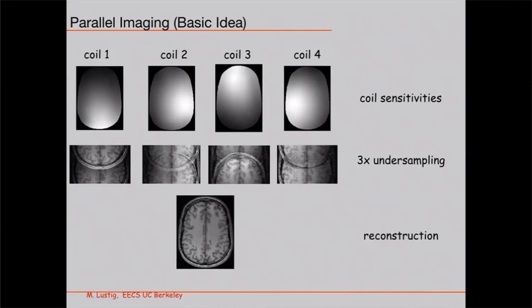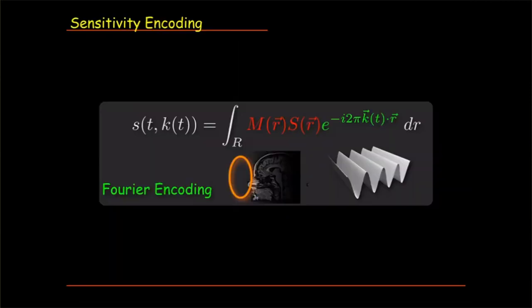If you have 4 equations, they need to be independent, right? And obviously they should be well conditioned too. So yes, we might be able to solve this because we have 4 equations and 3 unknowns, but it also depends on whether those are actually independent. And the idea then is to take all those aliased images and combine them in a certain way that will give me the uncorrupted image, the unfolded image. Okay, solve this folding.